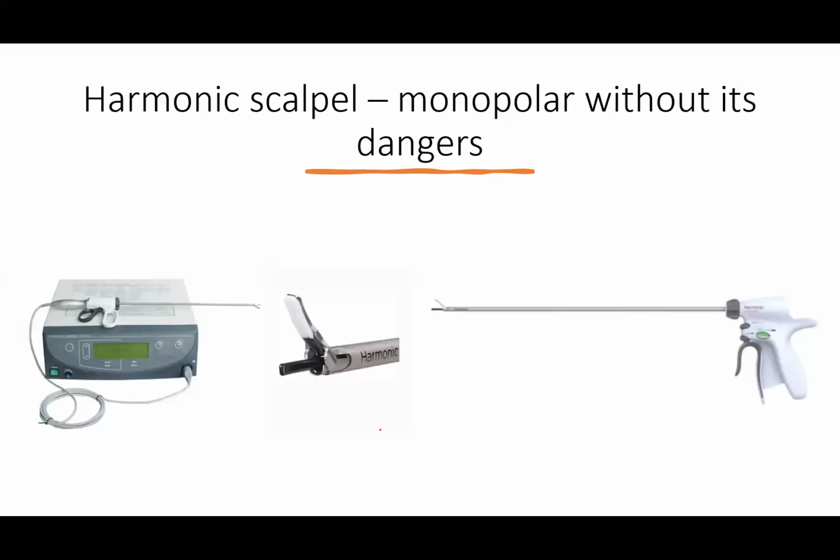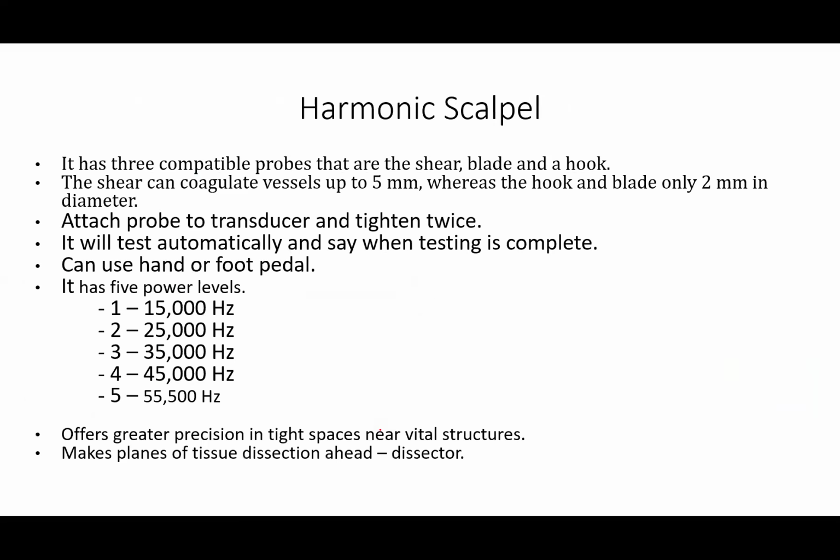Now, one of the disadvantages of this harmonic scalpel is the after-use heat effect. The tip will still carry some temperature, so if it touches another surface it can cause little burns.